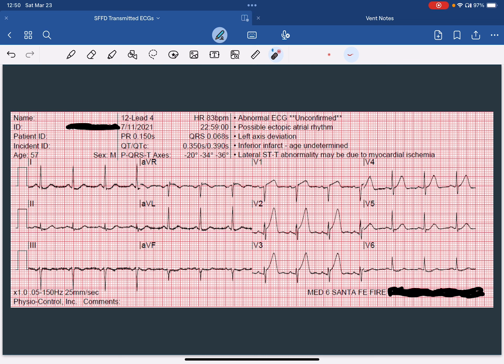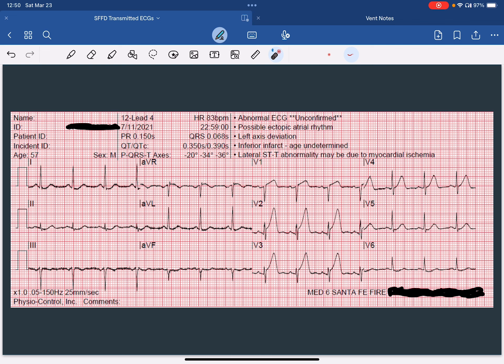Next, we're going to look at our intervals. It looks like we do have P waves preceding all of the QRS complexes, which appear to be narrow. There is also a T wave present. The rhythm itself is regular with not a lot of variance, and it is a sinus rhythm.